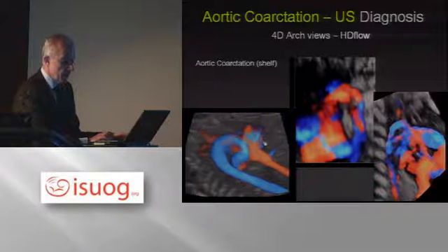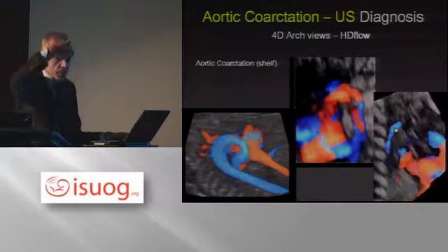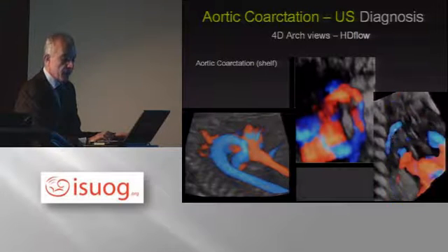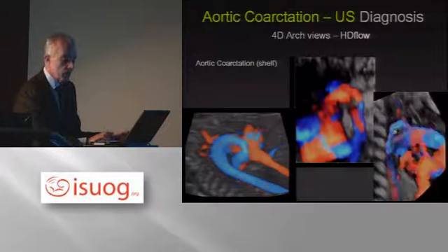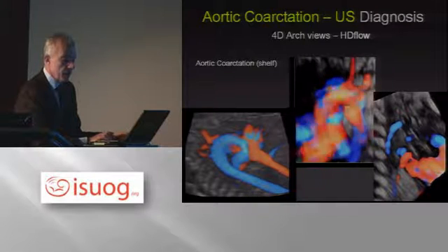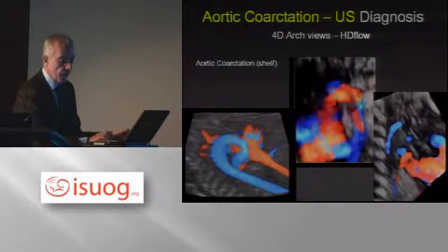And again, this is a normal longitudinal view of the aortic arch. You see no narrowing here and the three-vessel view here. And these are two cases of tubular hypoplasia. And you see here how nicely you see the tapering, because the arch is also hooked up if it's severely hypoplastic. And you see also that there is some persistence of blood flow in the arch after the systolic peak. And this is consistent with the so-called diastolic runoff, which is typical of severe coarctation. And so this is for the tubular form, and this is a case of shelf, the same case I showed you before in inversion mode, and you see here the shelf.